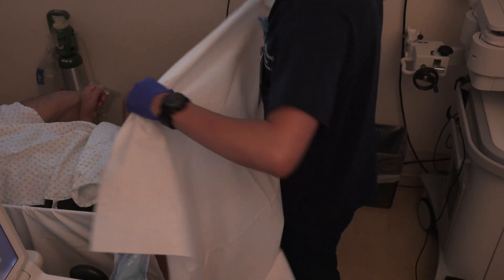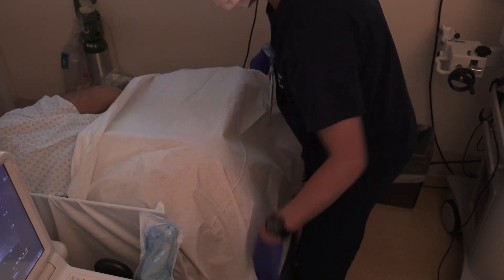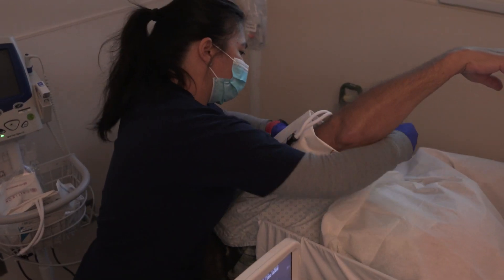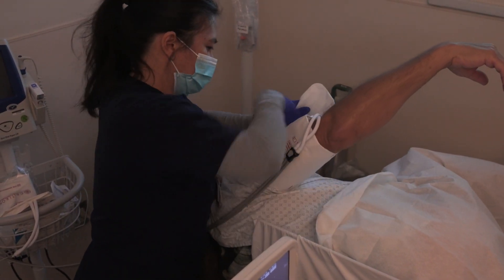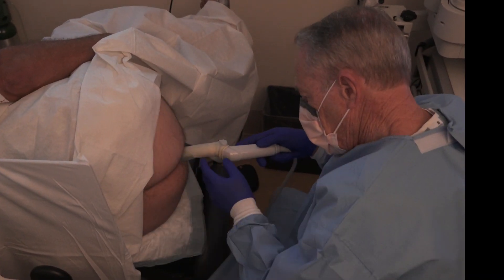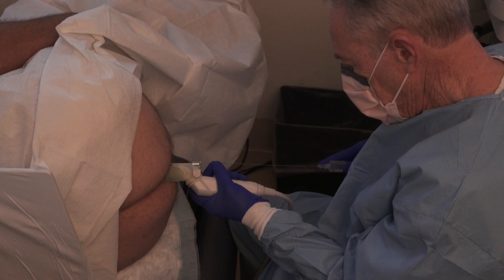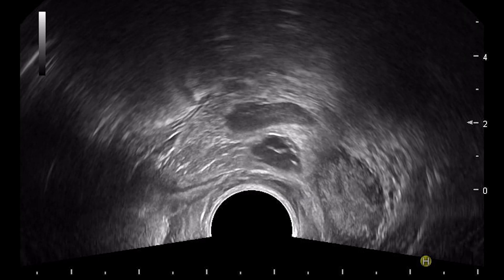The patient is positioned in the left lateral decubitus position in similar fashion to a transrectal biopsy. Vital signs are taken at the beginning of the procedure and may be taken periodically during the ablation. Insert the transrectal probe as for biopsy and anesthetize the prostate in the usual fashion.